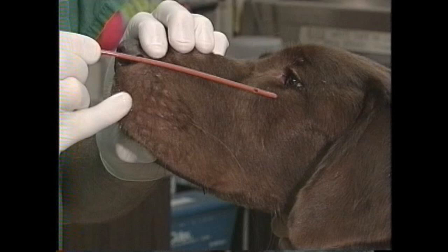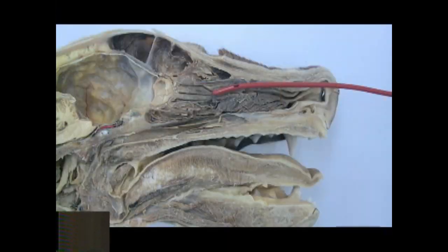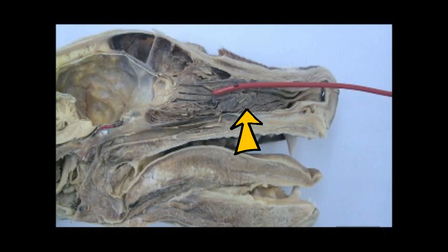In the next attempt I'm going to advance it just inside the nostril and then be even more aggressive with the mushing and pushing to get it below the middle turbinate. In this sagittal section of a cadaver dog you can see the arrow pointing to the middle turbinate, and the catheter has positioned over that and stops up against the ethmoid turbinate as indicated by the second arrow.